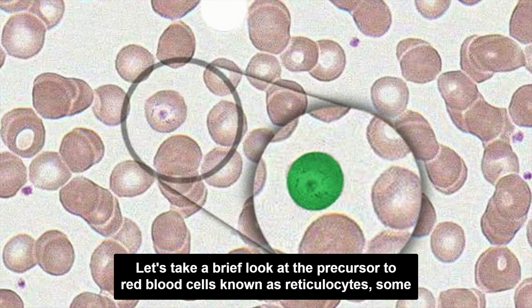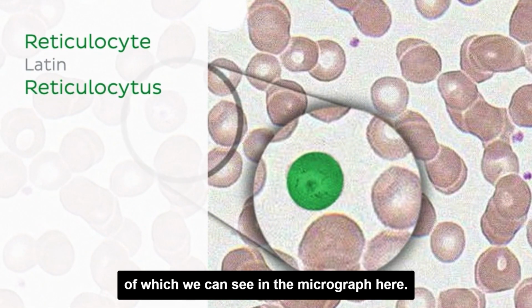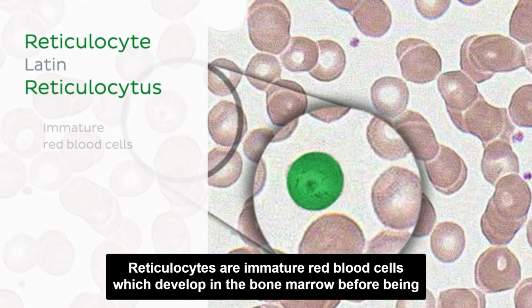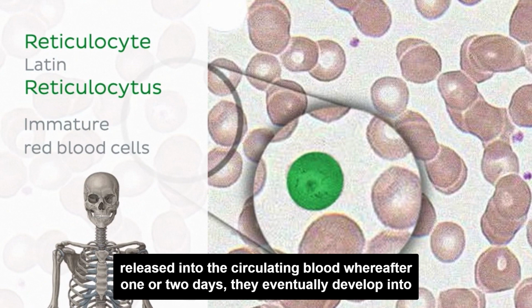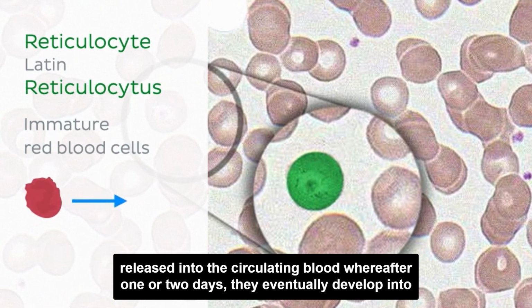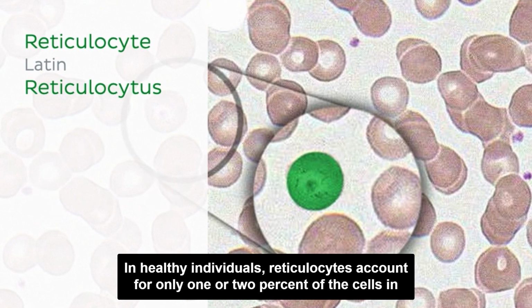Let's take a brief look at the precursor to red blood cells, known as reticulocytes, some of which we can see in the micrograph here. Reticulocytes are immature red blood cells, which develop in the bone marrow before being released into the circulating blood, where after 1 or 2 days, they eventually develop into mature red blood cells. In healthy individuals, reticulocytes account for only 1 or 2% of the cells in blood.